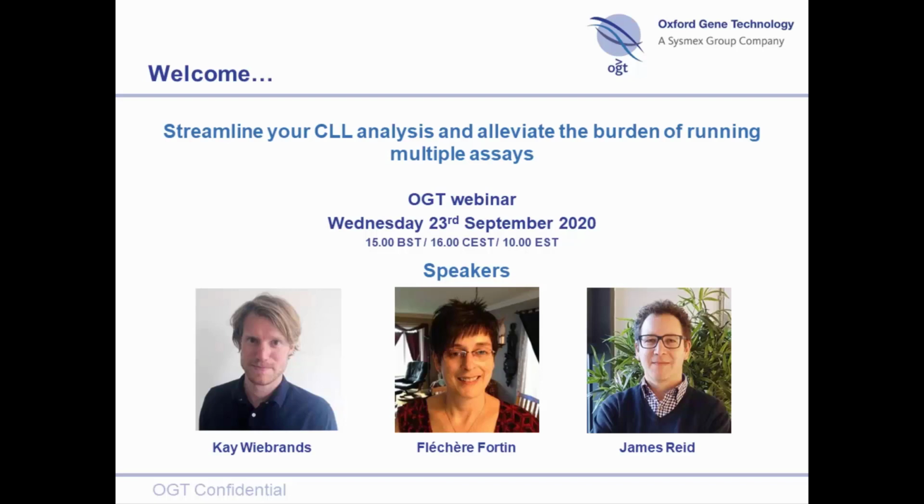Okay, right. In fact, for what I know, the technique used to detect the IGHV mutation is not like detecting a CNV. It's much more by seeing if there is a lot of recombination in the region, which will make the hypermutation of IGHV. So it's really not the same kind of mutation. We use the same term, but it's not biologically the same. So it's technically not the same way to obtain the result. Okay.